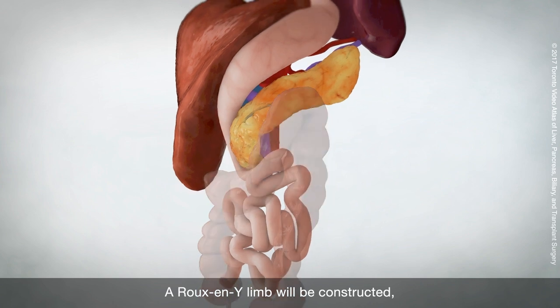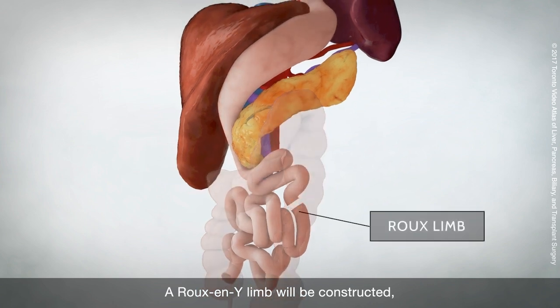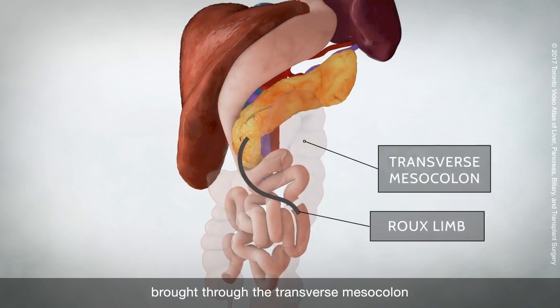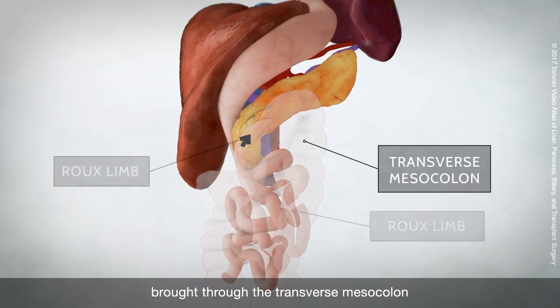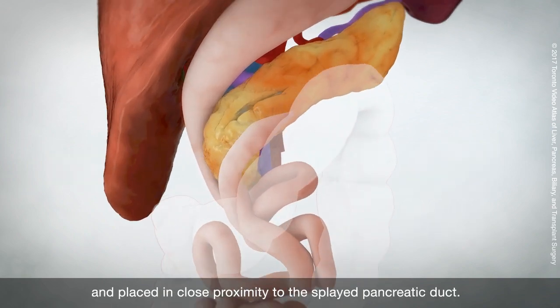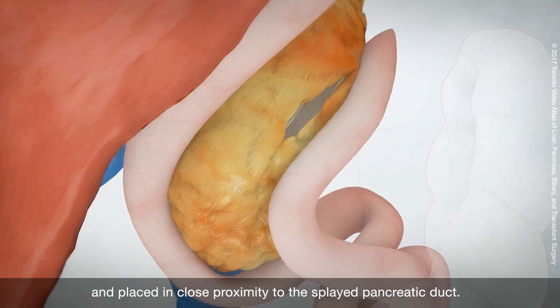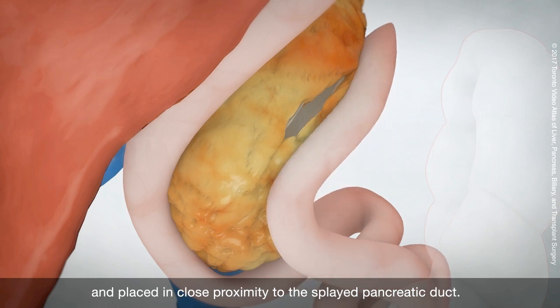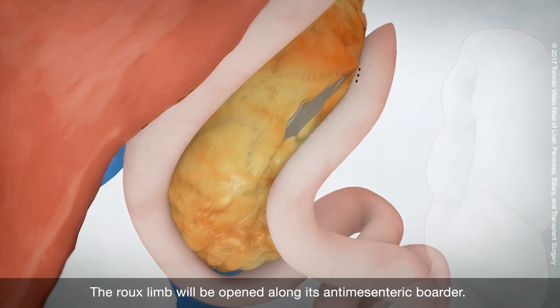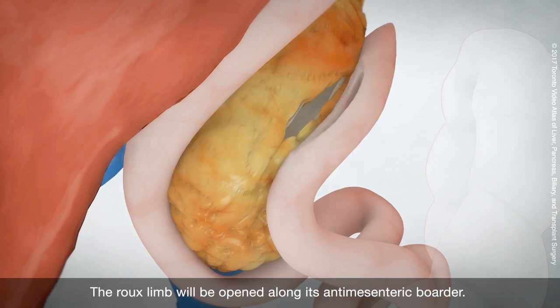A Roux-en-Y limb will be constructed, brought through the transverse mesocolon, and placed in close proximity to the splayed pancreatic duct. The Roux-en-Y limb will be opened along its anti-mesenteric border.